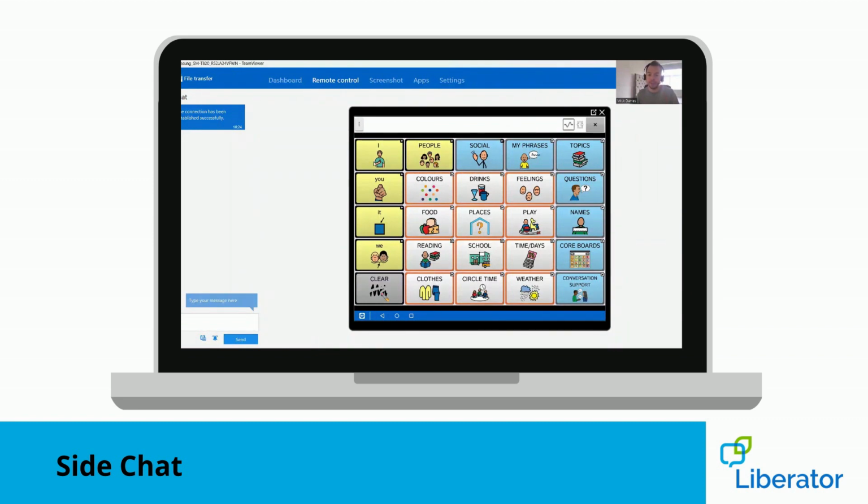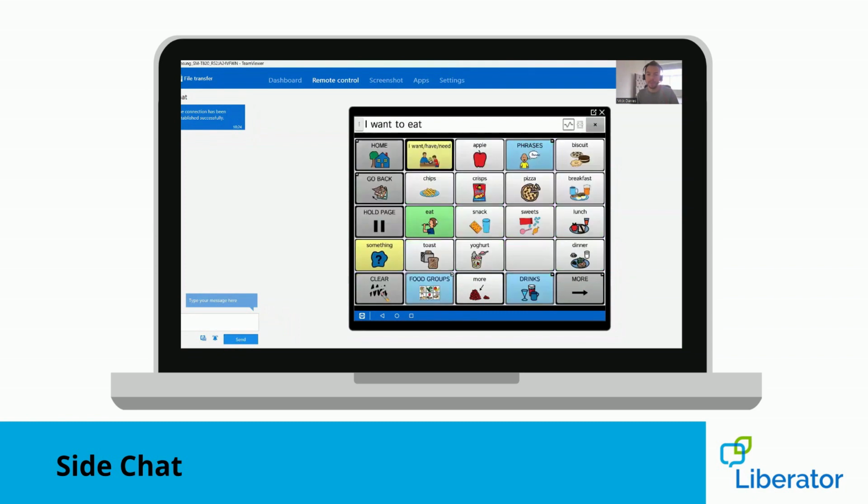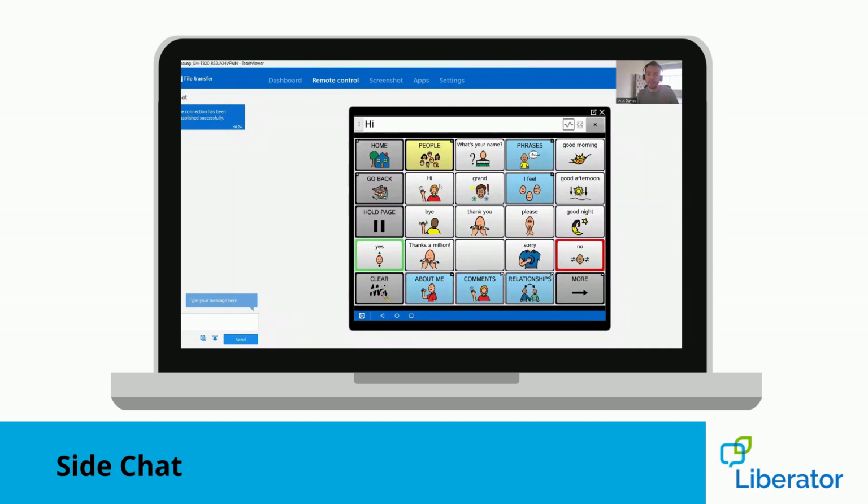So I could be having a conversation with someone about which food I would like to eat. And before I make my choice, someone else might come into the room and say hello to me. I can quickly toggle to a second screen, pressing this number 1 in the top right hand corner. That goes to number 2. I can say hi. And when I toggle back to area 1 or speech display bar 1, that will remember exactly where I was. So I've got I want to eat already created.